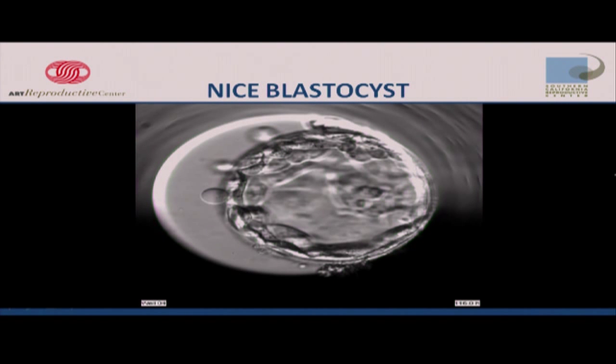Now that was sped up really fast compared to what you were shown, and there are reasons that we put it together real fast like that. Any patient that actually gets pregnant, we give them baby's first video of that exact type of thing, because you can't get a video earlier than this. I mean, there's a sperm and there's an egg, and well, you can't do anything there. After that, you can get this. So we give this away as a nice little treat when they get pregnant, so that they have a very early baby video. So that's what a nice one looks like.